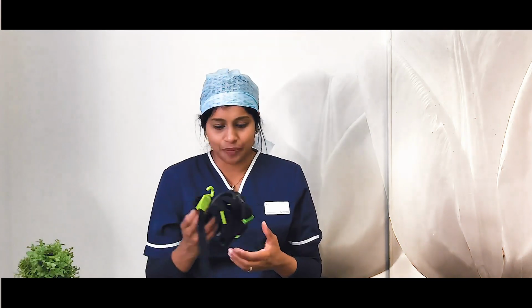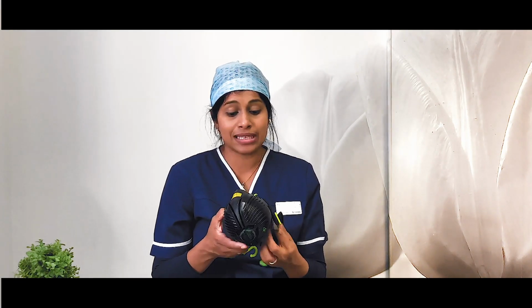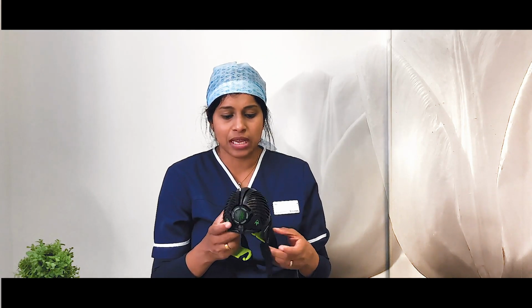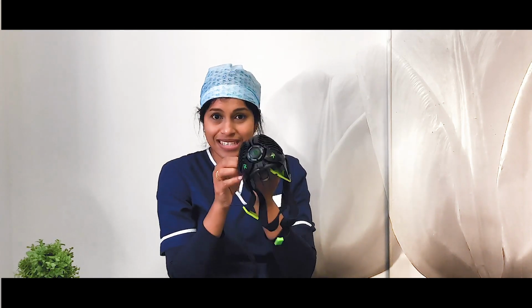So we will come now on to the reusable FFP3s. The reusable FFP3s, this is one of the most common masks that's used in the UK now. This is a Stealth mask. Again, there are a few different types. There is a similar one which is grey in colour as well, which I will put a picture of. I did try that. Funnily enough, I failed with that mask, but I passed with this. These are reusable, so all you do is wipe them clean, and they come with filters. So you just have to change the filters. The filters probably you've got to change maybe once.